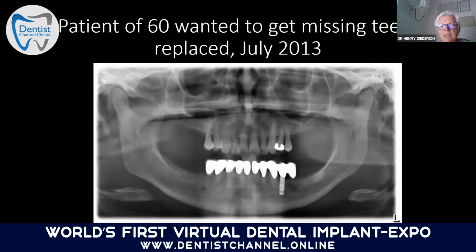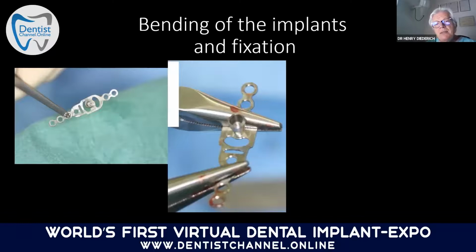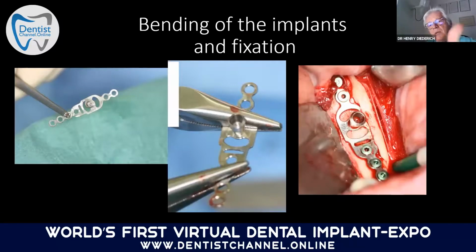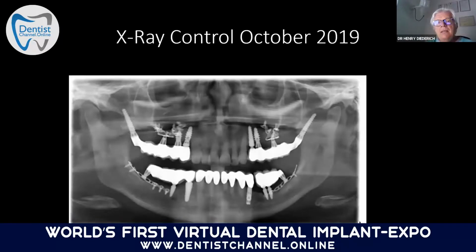These are very difficult cases because you see it is bilateral and she was missing teeth, and this case was done in 2013 already. And then you may imagine, we are bending the implants, we are fixing it here in the mandible, we are preparing the bed, and that was a finished case 10 days later. It was done in one-shot surgery under local anesthesia. And here you have 6 years later, the result, everything is still in mouth. There's a little change on the left mandibular side, but everything is fine, no complications, and functional.